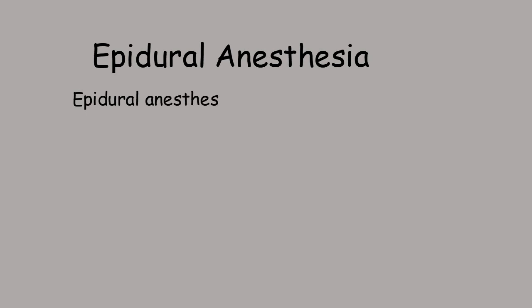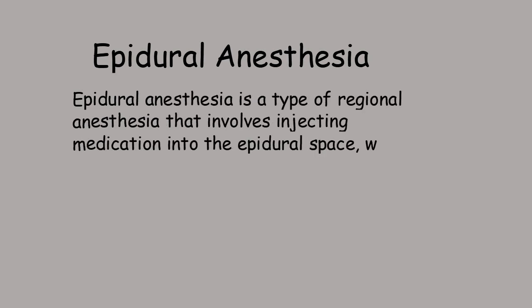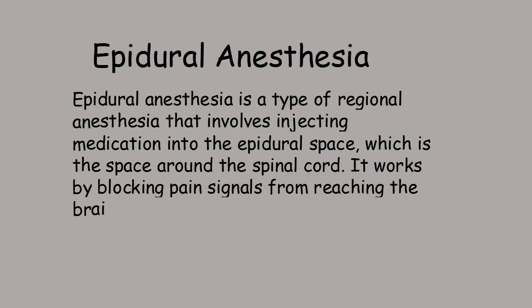Epidural anesthesia. Epidural anesthesia is a type of regional anesthesia that involves injecting medication into the epidural space, which is the space around the spinal cord. It works by blocking pain signals from reaching the brain.